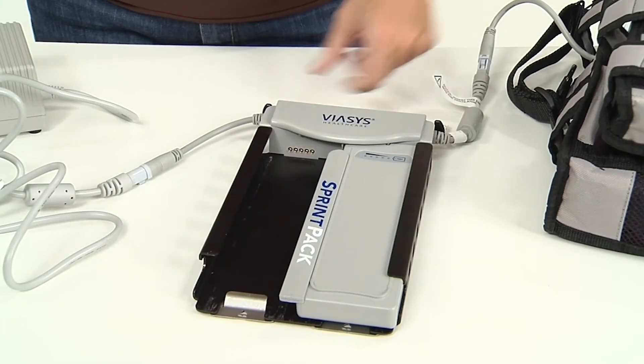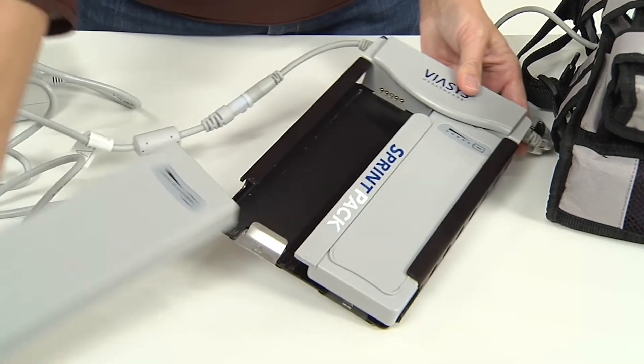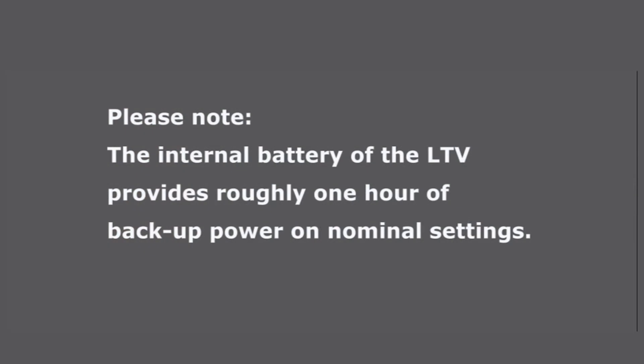You may swap out either Sprint pack battery with a charged one, or use just one at a time, with no interruption of power to the LTV, if the remaining power cell is charged and properly connected. Please note the internal battery of the LTV provides roughly one hour of backup power on nominal settings.